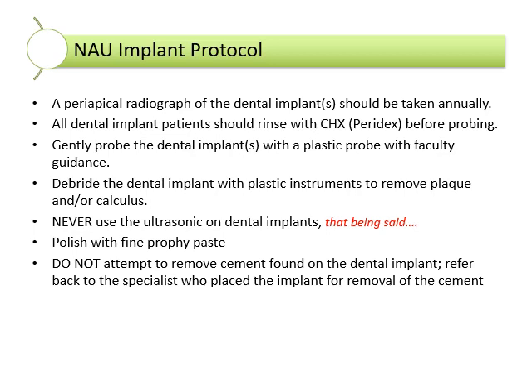In our clinic, that being said, we're not going to use an ultrasonic hand instrument or anything other than plastic on a dental implant. So go ahead and read through the next 2 slides at your own pace.